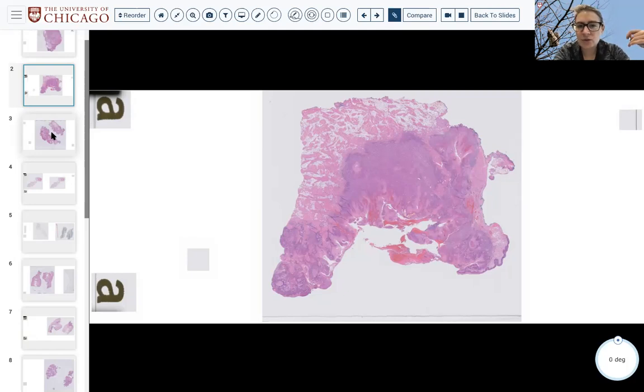And I think the best thing to do is to go over it with a couple of pairs of eyes, with a PA, with the attending, so you can all decide together what to do. If it's very white, very gritty and very firm, that's more likely to be tumor. If it's softish, yellowish white, not so gritty, and you know the patient has had treatment and it's a little more ill-defined, that is more likely to be treatment effect. That being said, you can have tiny islands of tumor in treatment effect. So it's challenging.